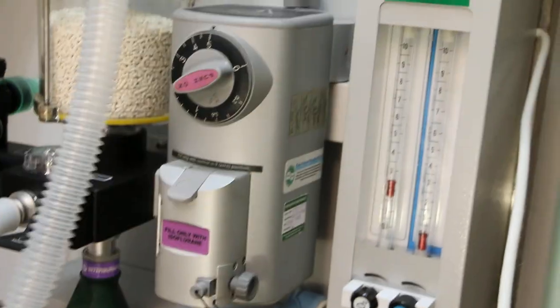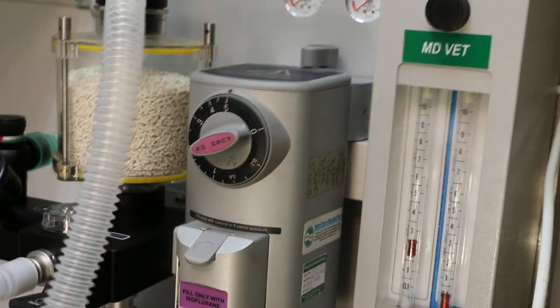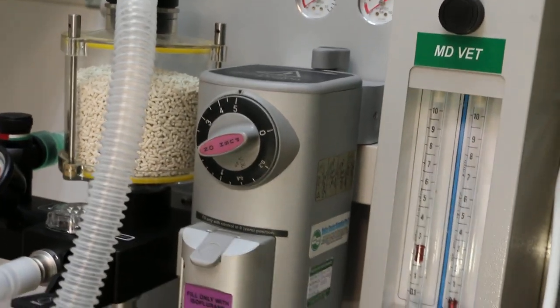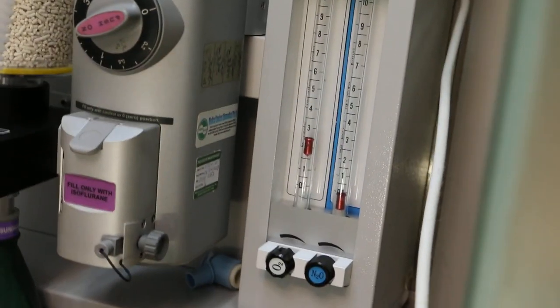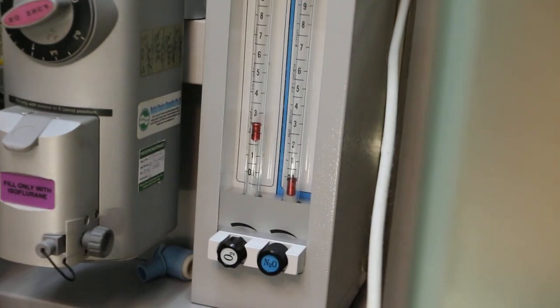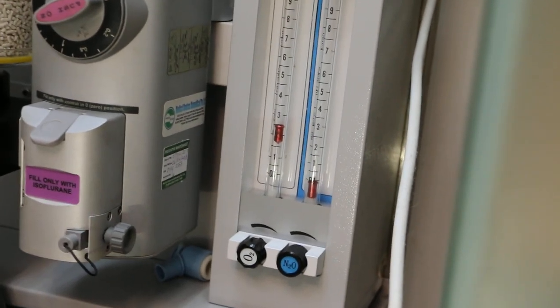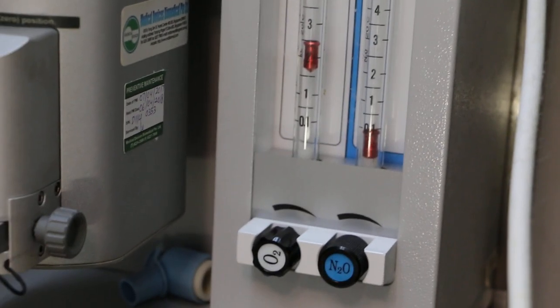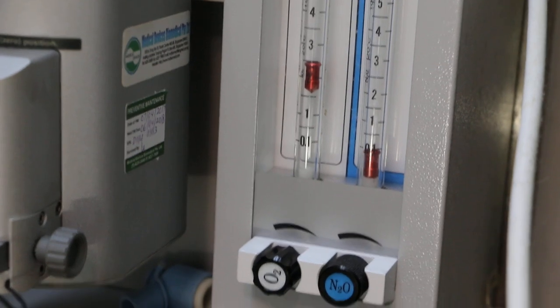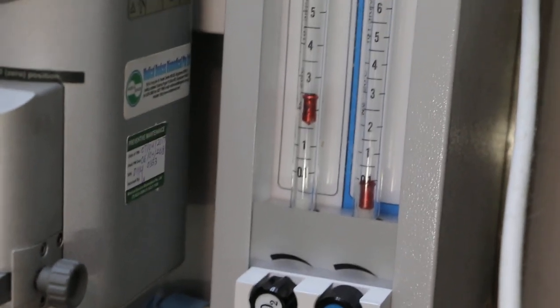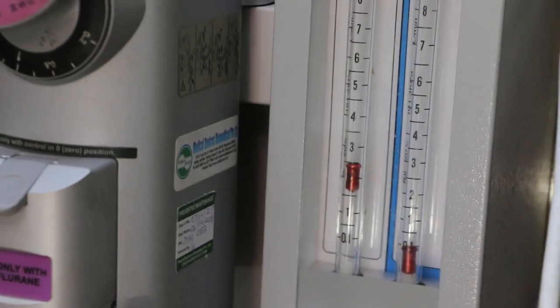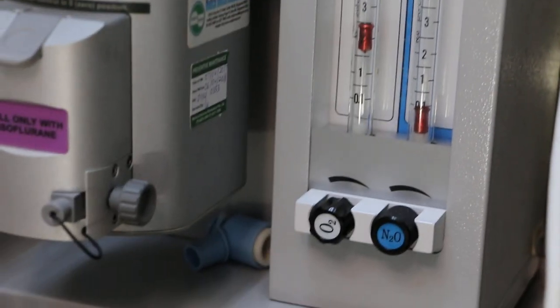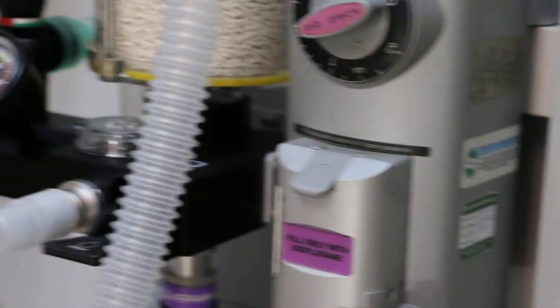Five percent, flow rate about two liters per minute oxygen, and the hamster is down.